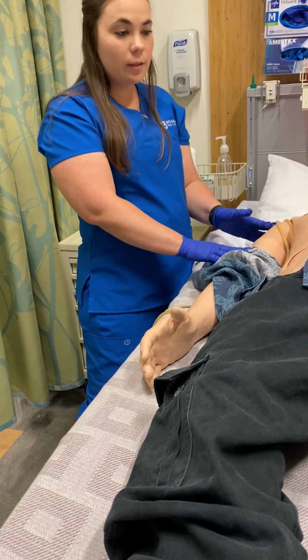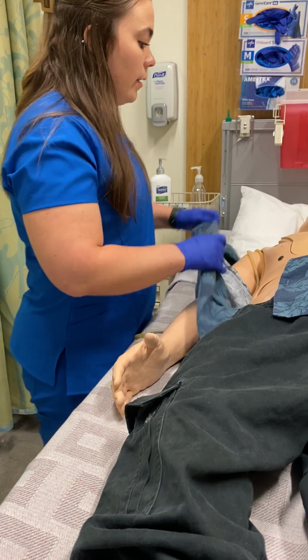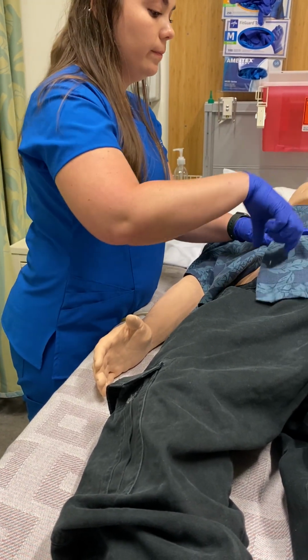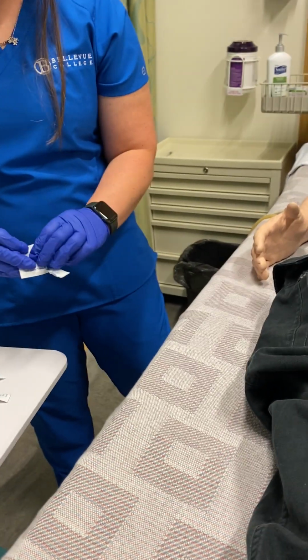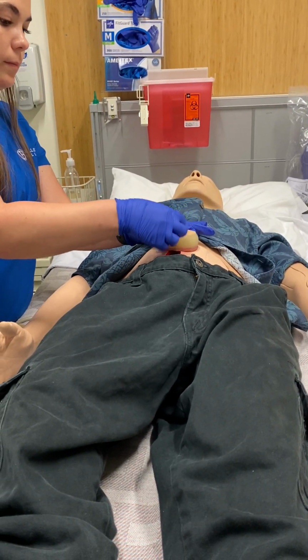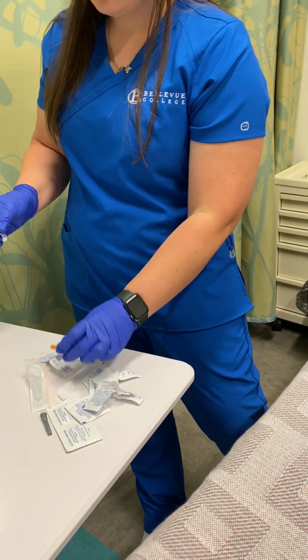Before administering, you would check the area for any tenderness or irritation so that you're not further irritating the area. And then moving on to the subcutaneous insulin, we're going to expose your tummy. You'd again cleanse the area. Uncap your needle.